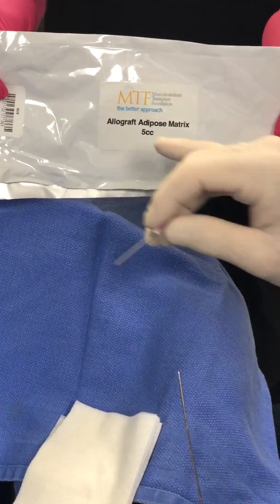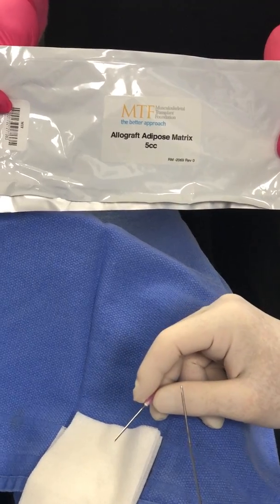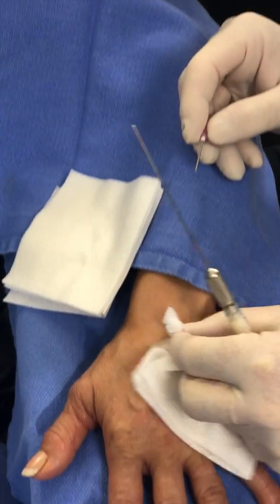Today we're doing MTF allograft adipose matrix. I'm going to do 5 cc's per hand for dorsal hand rejuvenation.